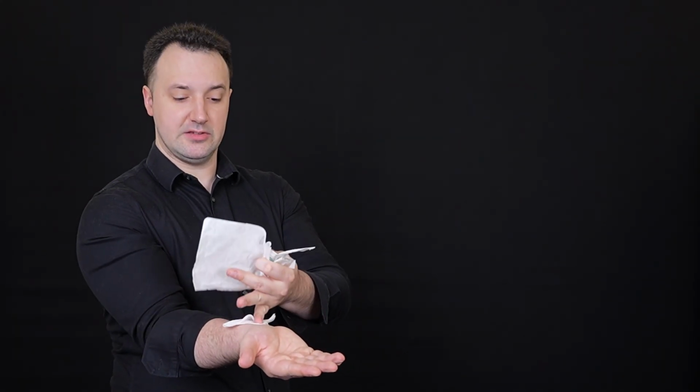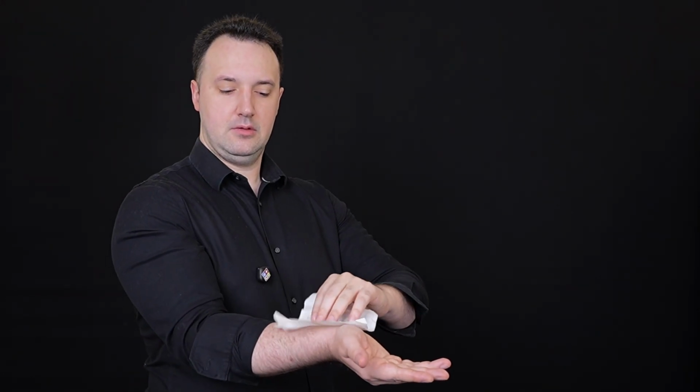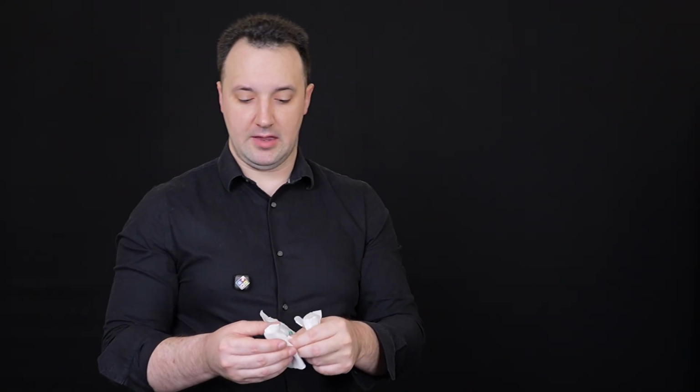If it's bloody, it sticks on, and then peel off, right? That's the idea. Now, if I'm doing this with two hands and not one on somebody else, it's a bit easier, but you can peel it off and then attach. If you can do that in under 10 seconds, your chance of getting stuff in this before it gets on the person gets much lower. If it takes you longer, it takes you longer. Paramedics generally have standards on this sort of thing where they have to do it at a certain speed, but if you're not a paramedic, whatever, do what you can.